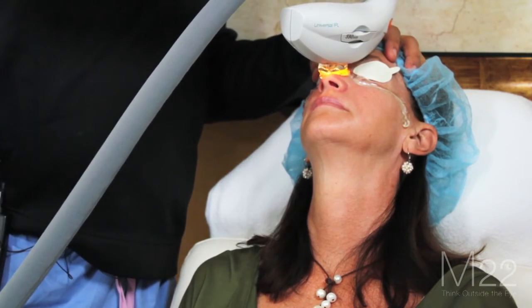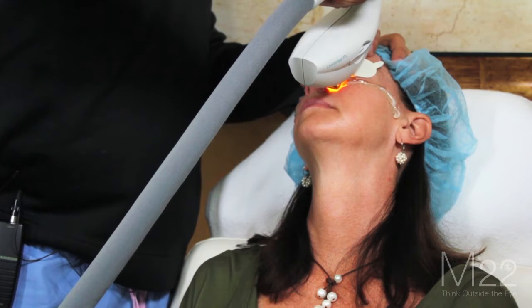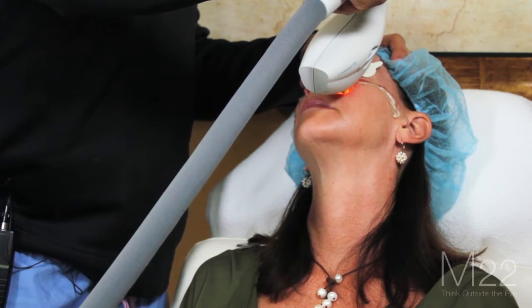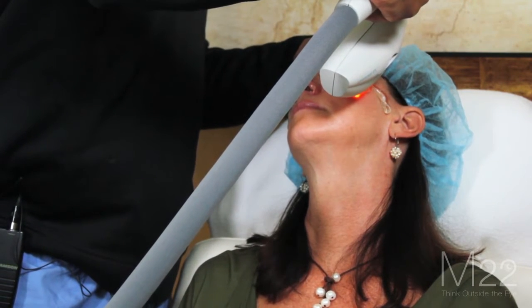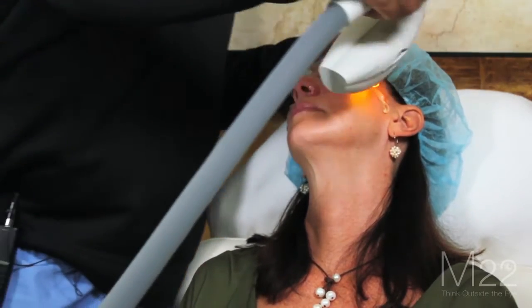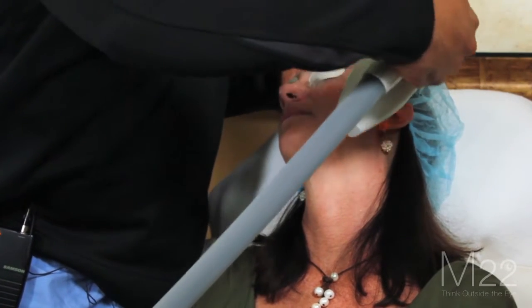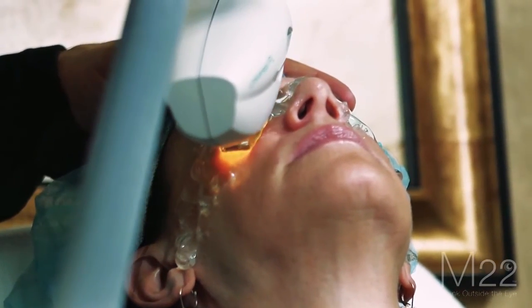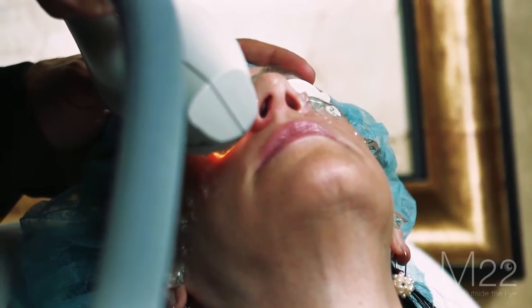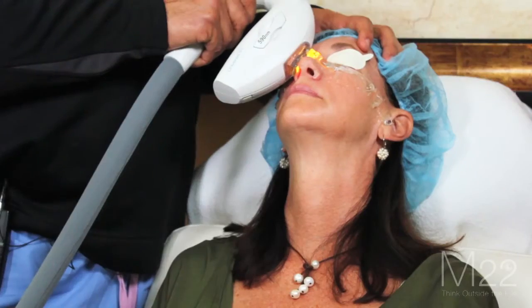The question I'm often asked is why don't we treat the upper lids? What we found was that the brow acts as a barrier to energy and heat. So when you treat the upper lids, that energy has nowhere to go — it sits on the upper lid, and it's too much energy, even if you lower it down to eight joules per centimeter squared. The importance of hitting four shots right on that lower lid margin, getting as close to it as possible, gives you the best results.